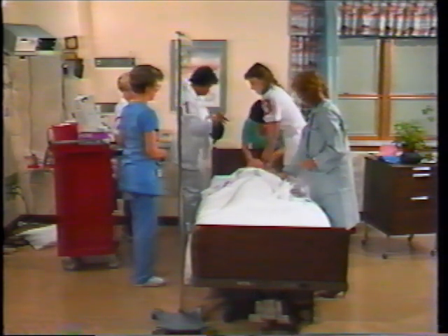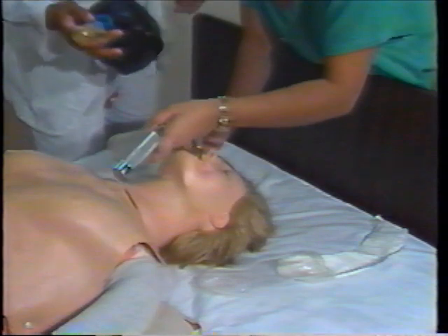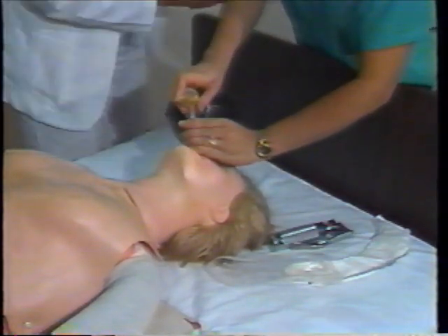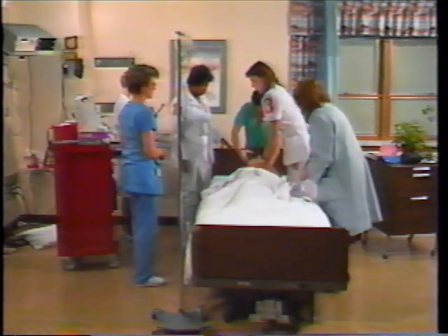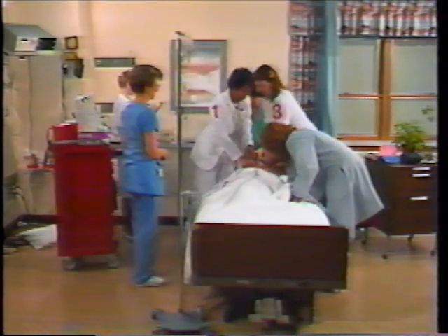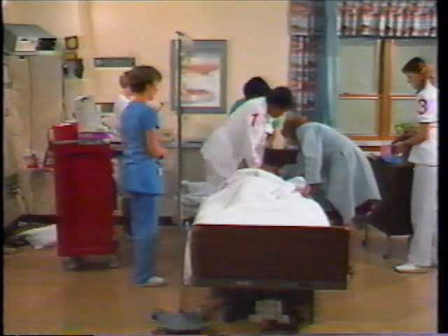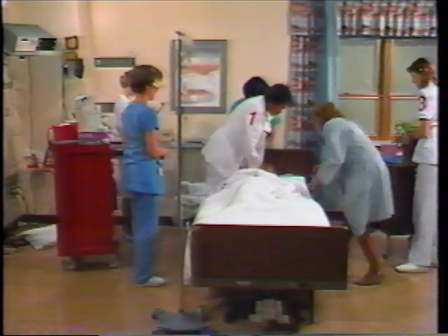Compressions are stopped briefly to allow for visualization of the vocal cords and insertion of the tube. Okay, it's in. Proper tube placement is checked by listening to bilateral breath sounds. 1, 2, 3, 4, and 5. 1, 2, and... Good bilateral breath sounds.